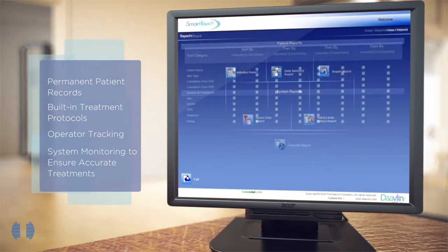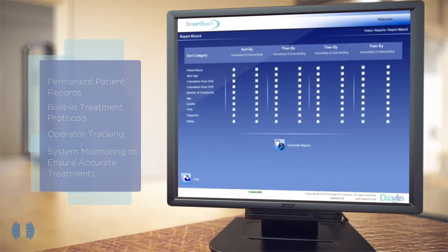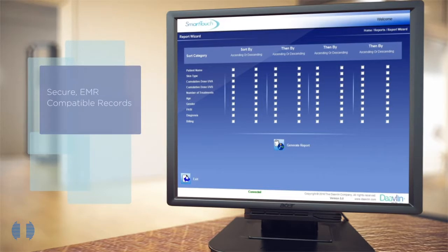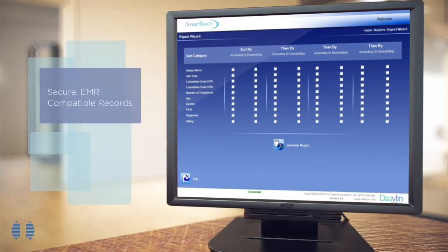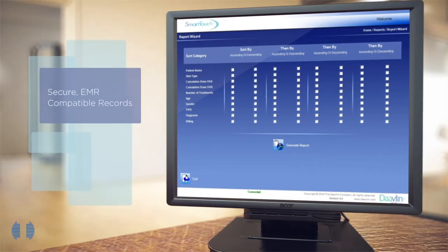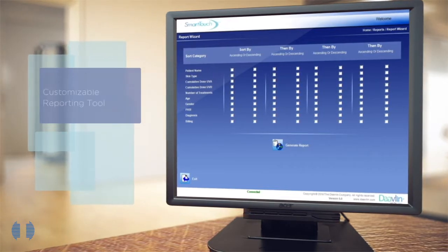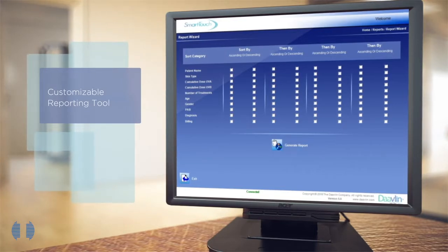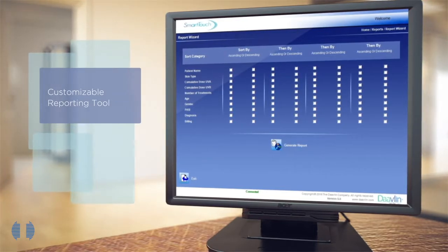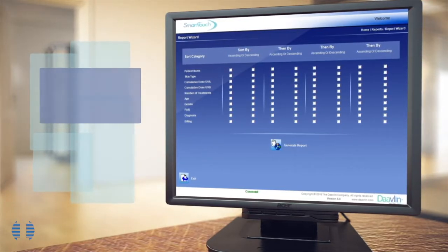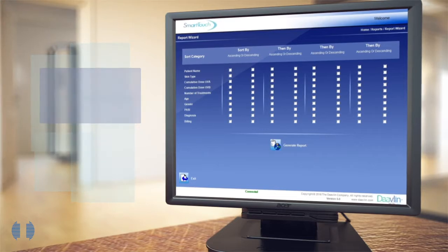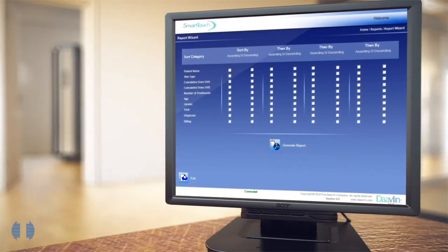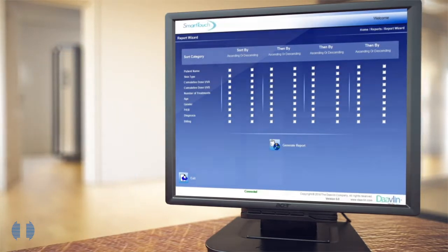Throughout treatment, Smart Touch keeps accurate, secure EMR-compatible records of the treatments delivered. The system's customizable reporting tool allows for easy review of patient records, providing backup if a patient's outcome or reaction to treatment is ever in question.